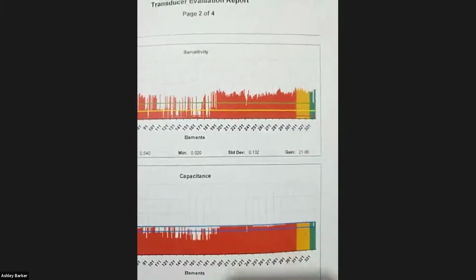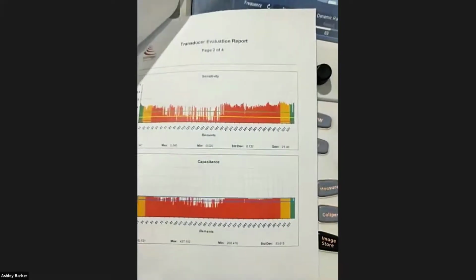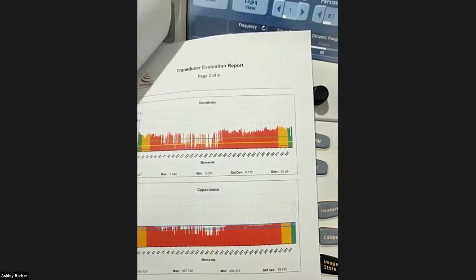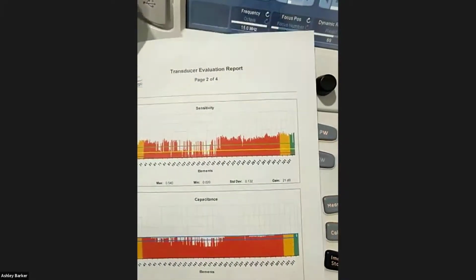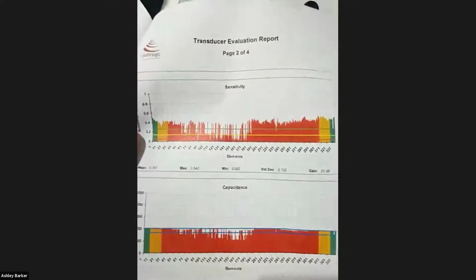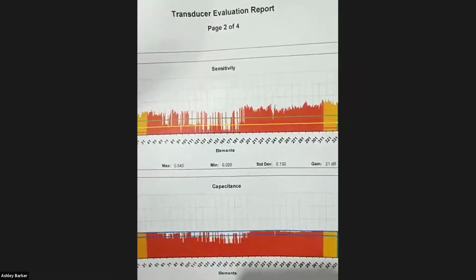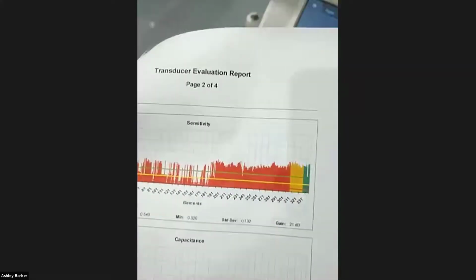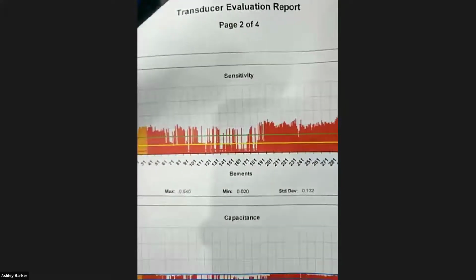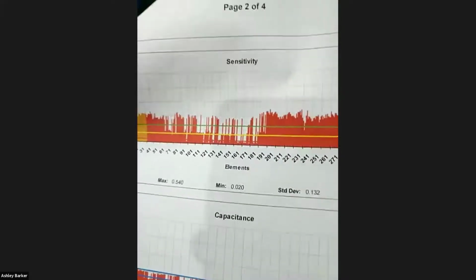So in terms of imaging, to give you some idea of what we consider to be a pass and fail, we consider no more than 3 dead elements, and no 2 of those elements adjacent to each other, to be our pass criteria, which is pretty much standard across the globe. And you can see that's got probably 20 times that out in that section. So that probe is just going to have a massive shadow in that region that's going to make it so hard to scan. There's just no point fighting your probes. You might as well get it sorted and get nice pictures.